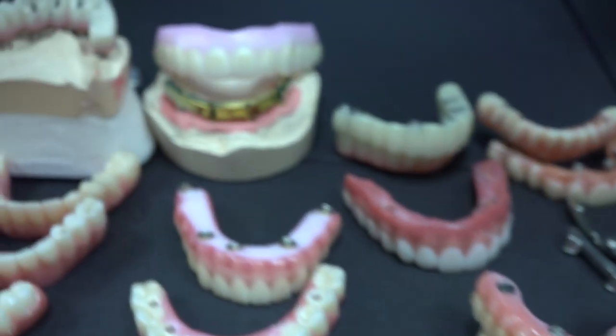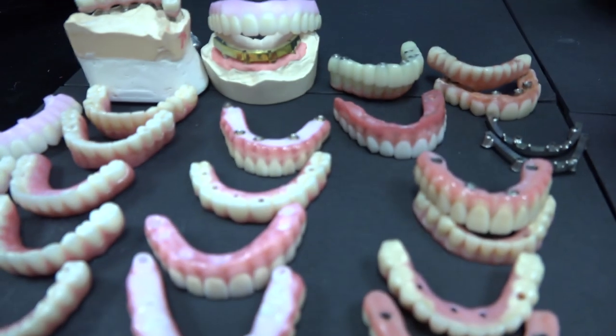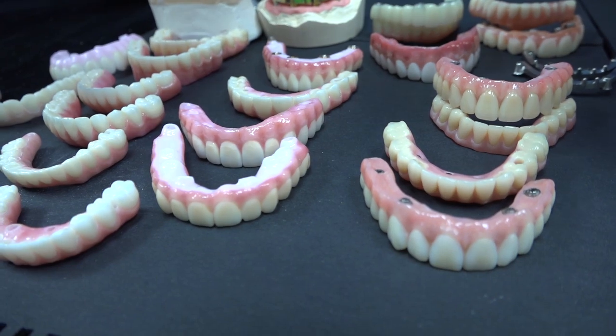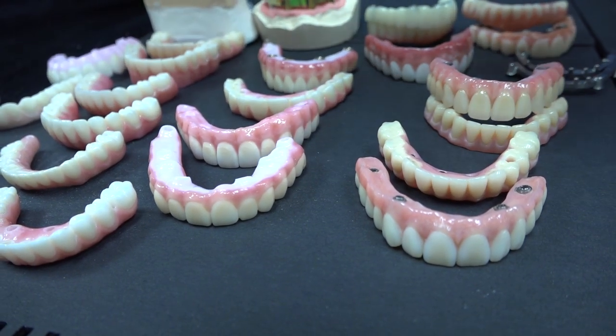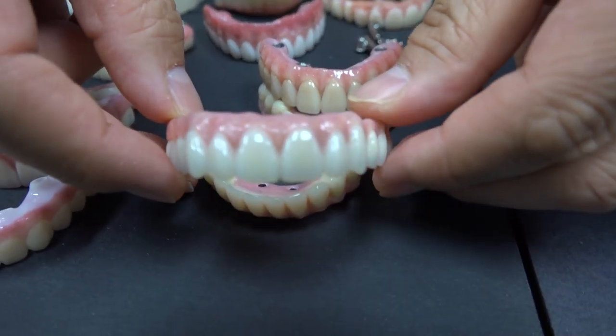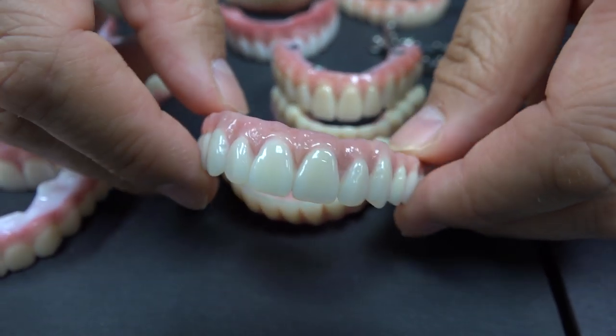I can explain one by one from the laboratory standpoint, which is we've been doing this a lot every day. This is a full implant made by great dentures, great artist skill.